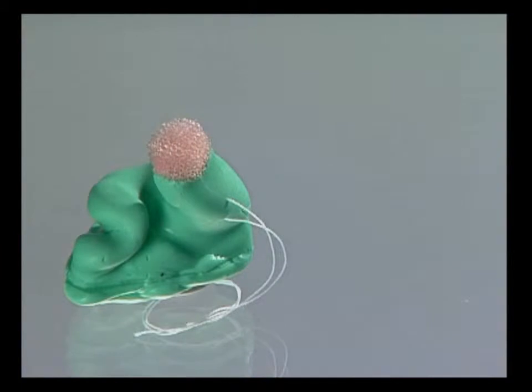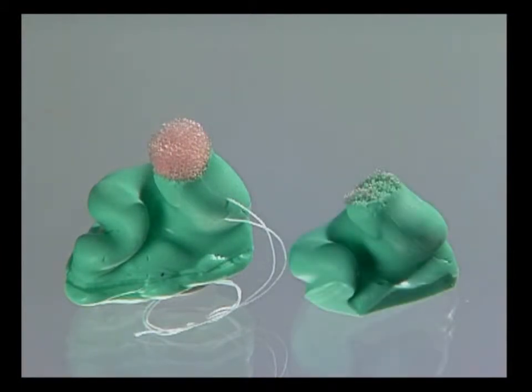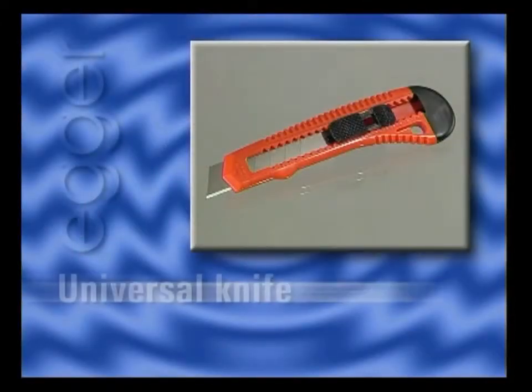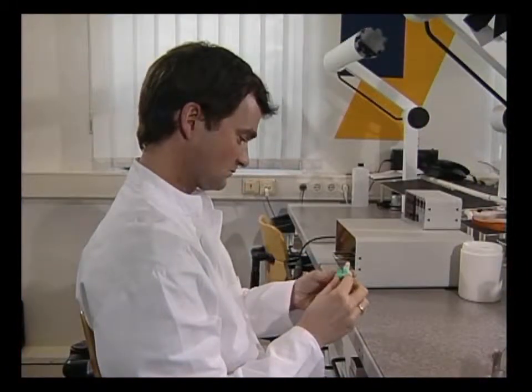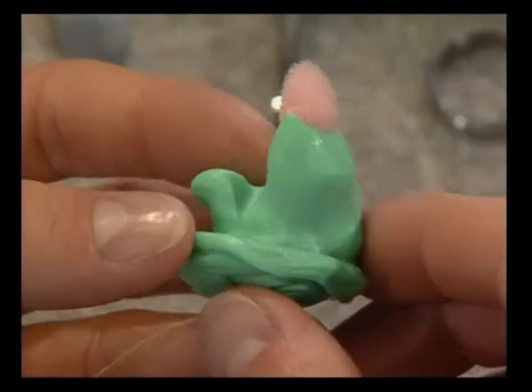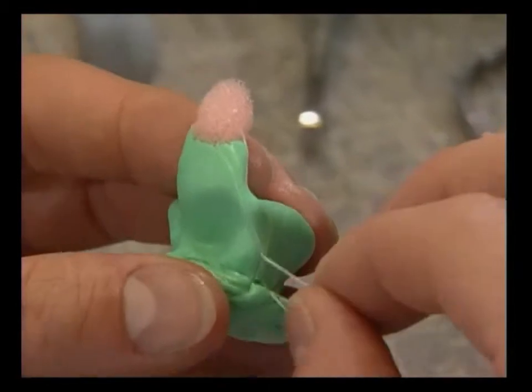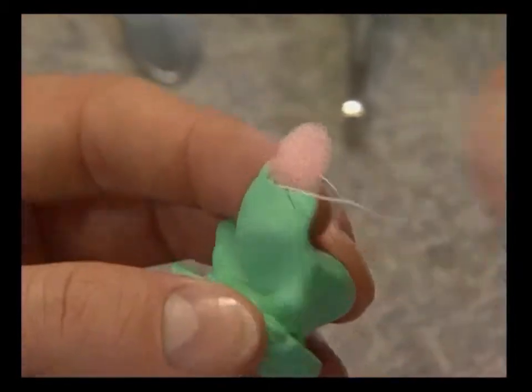The first step in the production of a transparent silicone control form is to cut the impression to size. A universal knife is used for cutting the impression. The thread with the impression plug is then removed.